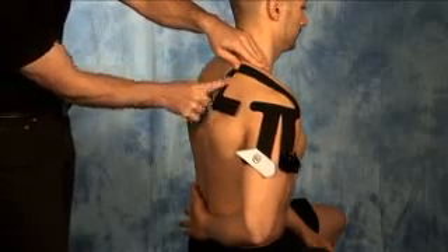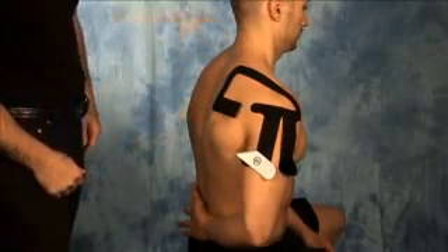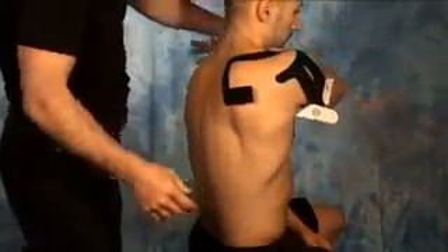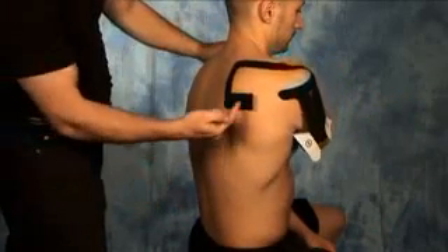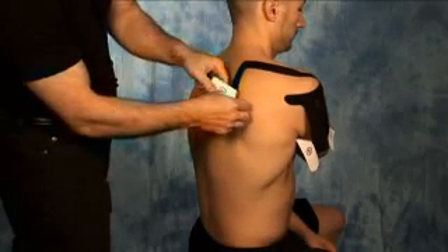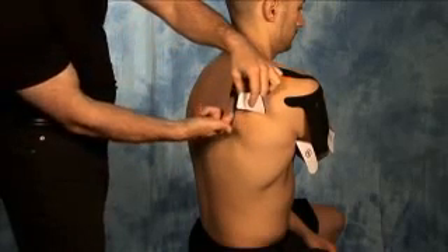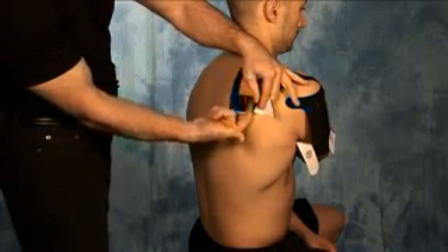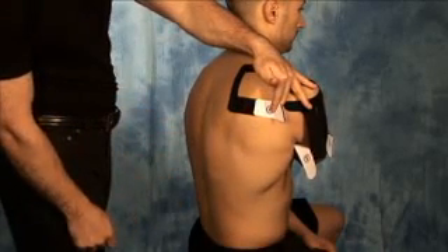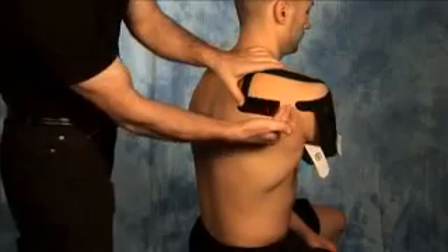Each section has to be applied before moving on to the next. Then take the arm, bring it across the front of the body, and rest the arm on the opposite shoulder, stretching out the infraspinatus. Tear back the backing of section number four, being careful not to touch the adhesive, and letting the tape come in gentle contact with the skin with no stretch. Once 90% of that portion is applied, tear the remaining portion off and gently rub the tape in to activate the glue.